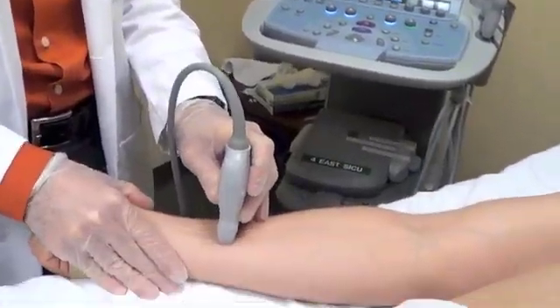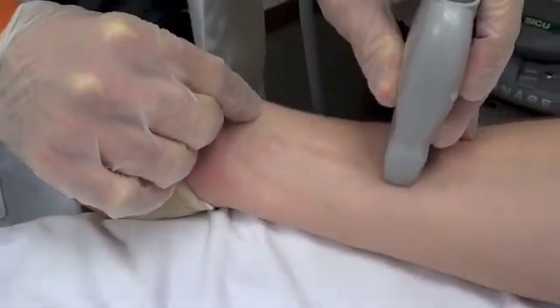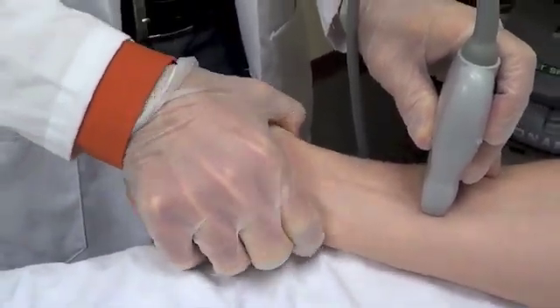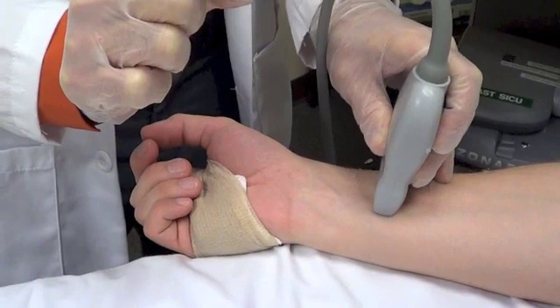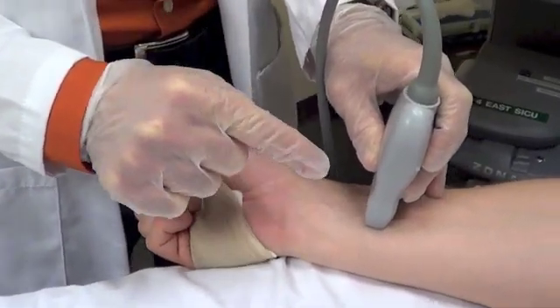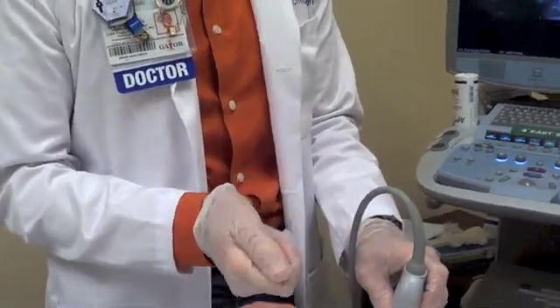The reason for going more proximal is that at the wrist flexure, the caliber of the vessel is smaller, and it's much more mobile simply because you're at a joint space. The second thing is that when radial cannulation is attempted without ultrasound, the vessel can actually spasm down, which makes advancing the catheter once cannulating the vessel with the needle very difficult.